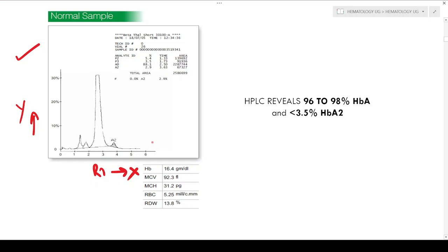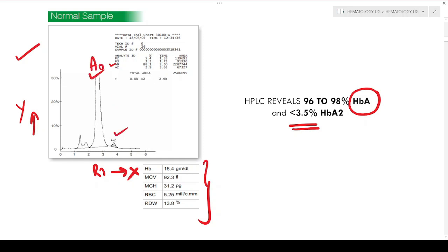This is a normal sample. All parameters are basically normal. In a normal adult, HbA is in the range of 96 to 98% — quite high. The A2 levels are less than 3.5%. This is the normal A0, this is the A2, and over here we have HbF and the different analytes — this is the normal adult sample.